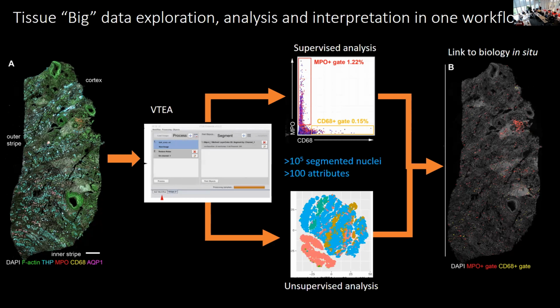And I think that's an important distinction because there are essentially toolkits and APIs that exist to allow you to do different aspects of this process, but the intent here was to unify it into one thing so that you can go from what are the adjustments that we can do in terms of image processing, changes we can do in terms of segmentation, and what sort of consequences that has in terms of the analysis on the other end. And then we can go backwards. We can go back all the way to the image processing because we realize we've done something inappropriately or less effectively, and then go all the way back to the analysis as well. And that gives us a sort of bi-directional access to both the original raw data and the analytic output.